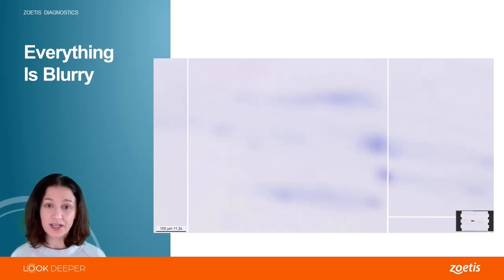So on my end, this is what I'm seeing when I'm typing to you that, hey, the sample is a little bit blurry. So you want to make sure that you absolutely have only one cover slip on those samples and that we're not putting the stain side down. How I usually like to avoid that is writing the patient name on the label side. That way I know which side the sample is on. And that's going to be most important for samples of lower cellularity, or even lipomas, where we're just not going to be able to tell easily which side of the slide the sample is on once it's stained.